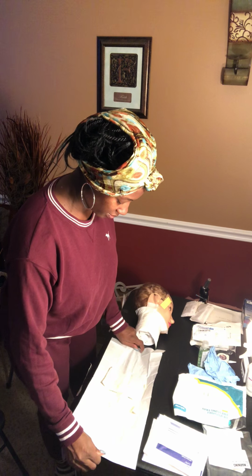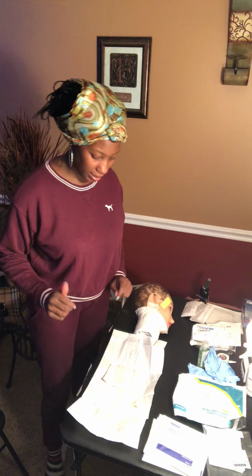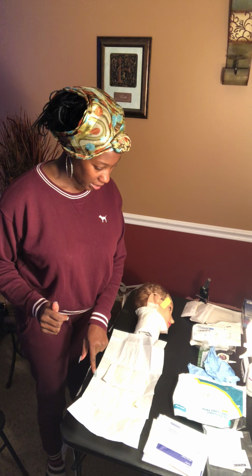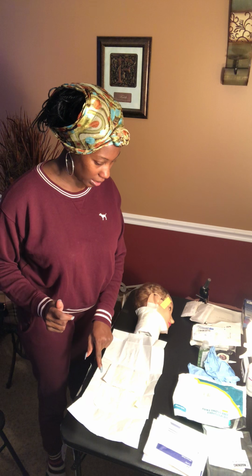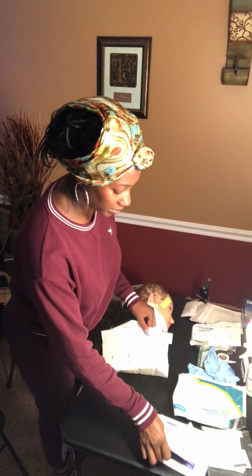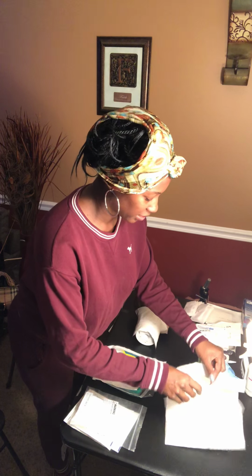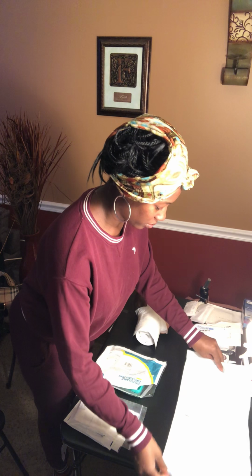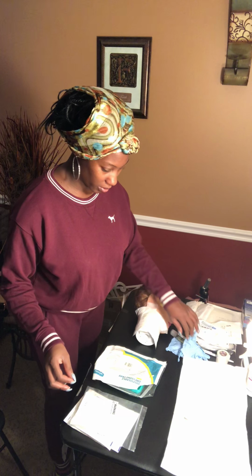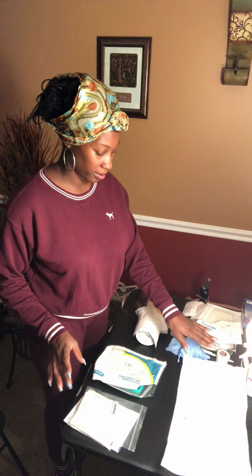You can see enough. So I open that. Because I'm right-handed, I'll be going to my left and grabbing this glove first. What I would do is put this up top so I don't reach over my sterile field. So I'm going to drop all my sterile stuff to the left.